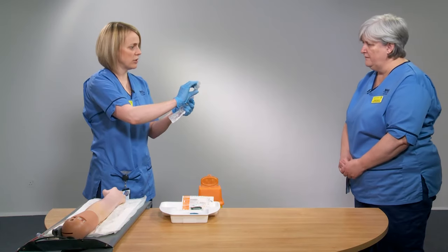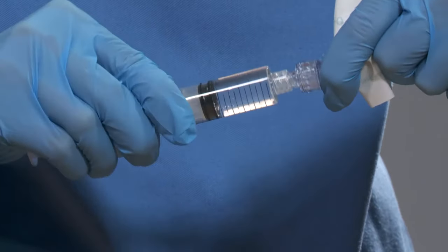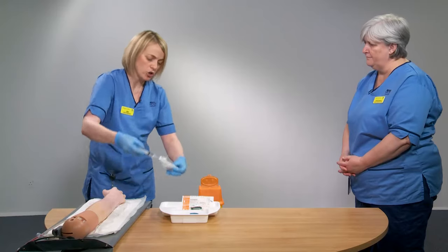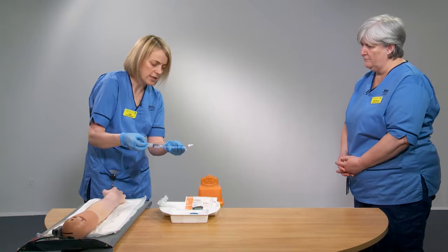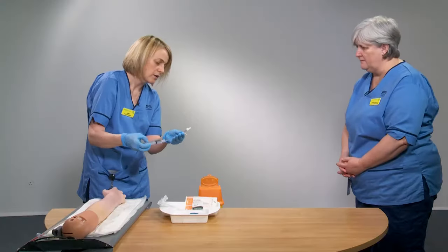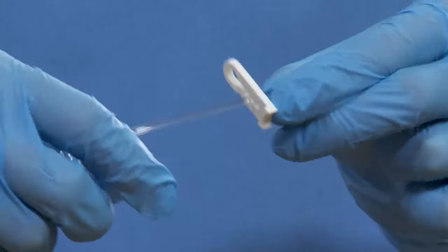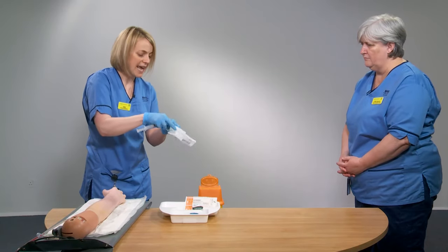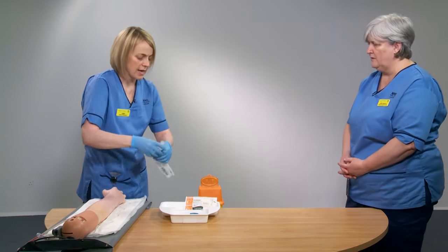At one end is the bung — this is where you attach the syringe. It screws on: push in and give it a good half turn until it locks. Then you gently push through the saline using the syringe plunger until you can see the saline at the very end of the device. Activate your clamp, then pop this back into the sterile packet to reduce the risk of contamination of your needle-free access device, and place that on the tray.